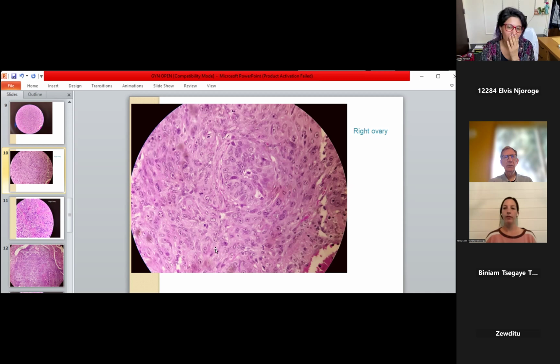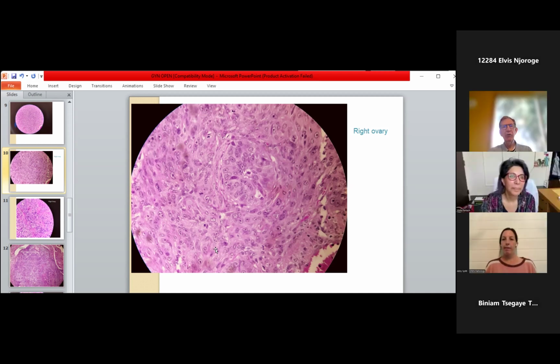Okay. Yes. Sometimes that's an issue where you have a stain that you don't see very much, making the right interpretation, especially with P53, which is a little bit challenging to interpret at times. Yeah. So thank you very much. Any other comments?